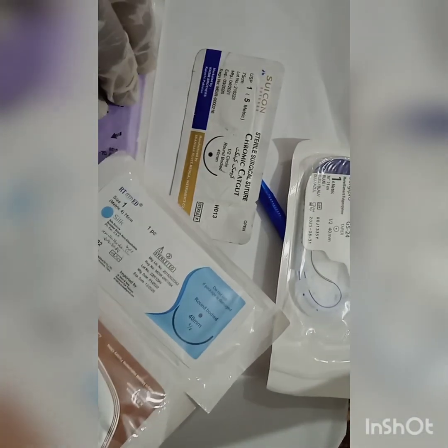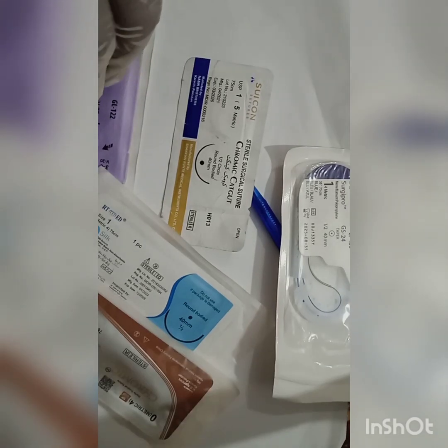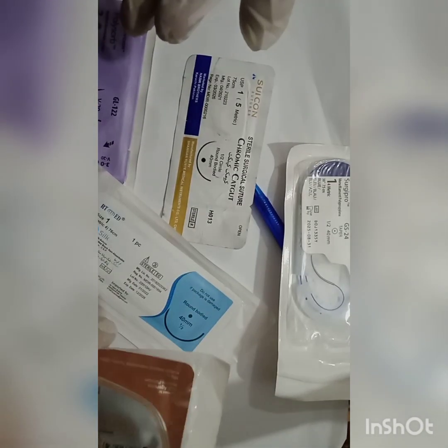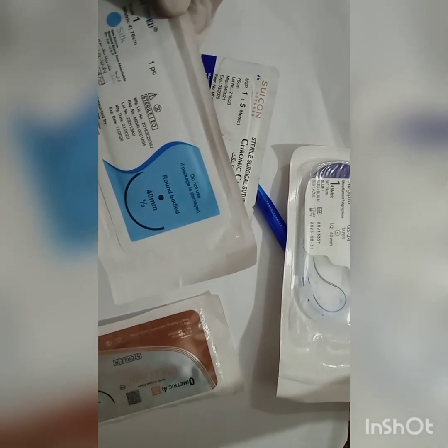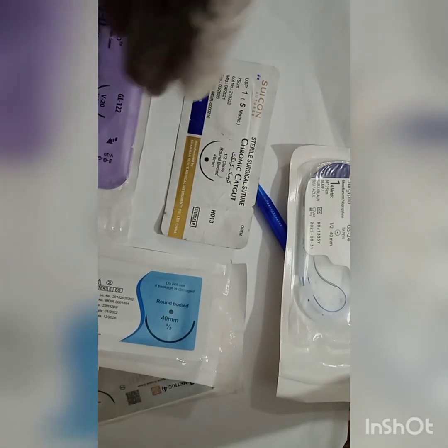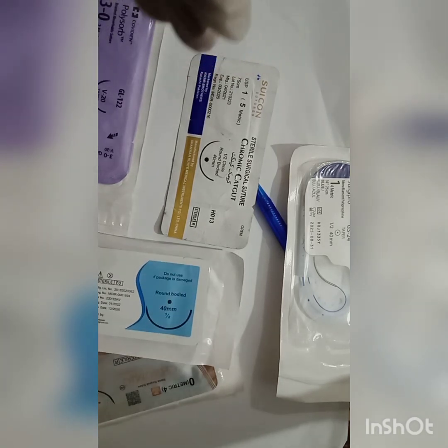So the silk and catgut are less likely used nowadays, except in some exceptional cases. If there is unavailability of the sutures, the catgut may be used. Otherwise, in most of the countries, they have quit using it. And the silk is more reactive to tissue and infective, so it is also exceptionally used in ligature of the vessels because of the stability of the knot.